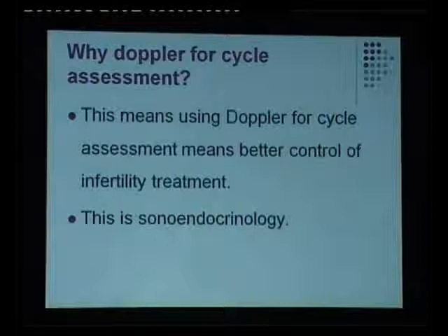So what you're going to assess with the Doppler is the response, and that is going to be very helpful in deciding the stimulation protocols for us. And this is what I think Dr. Vivek has already discussed, but just repeating it to emphasize it, and that is we by Doppler would categorize these ovaries into a normal responding, a hyper responding, or a poor responding.